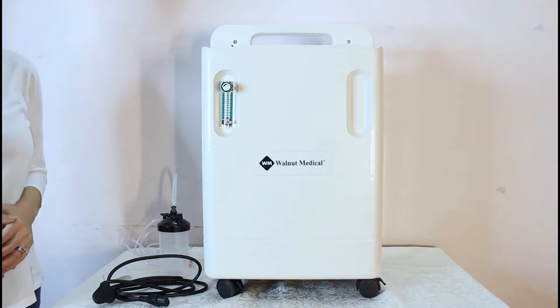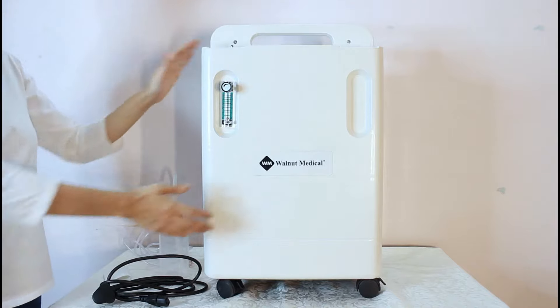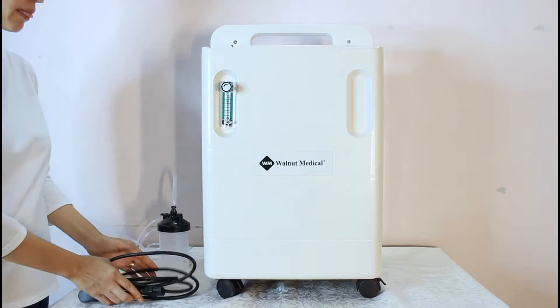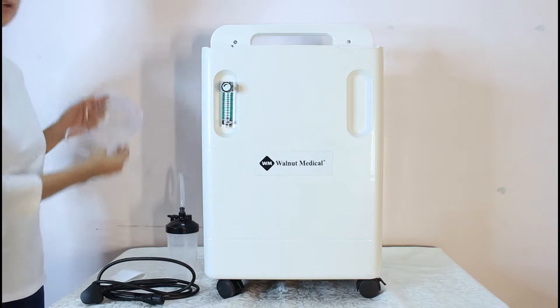This video explains how to install the Walnut Medical Oxygen Concentrator in a few simple steps. When you get the product, you will receive the unit itself, a power cord, the humidifier bottle, a spare filter, and the nasal cannula.